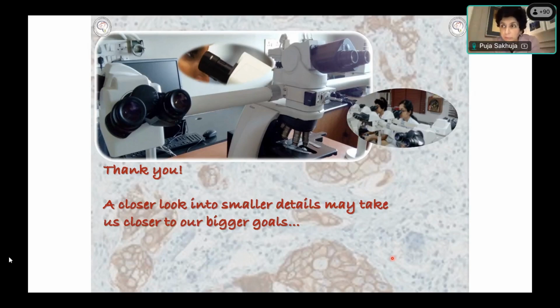For us, we may not be able to call it a healing area, right? So we have to just describe what we are seeing. We said that there was no definite polyp, and we just saw normal crypts, a little bit of inflammation and fibrosis, but no well-defined polypoidal structure was seen.